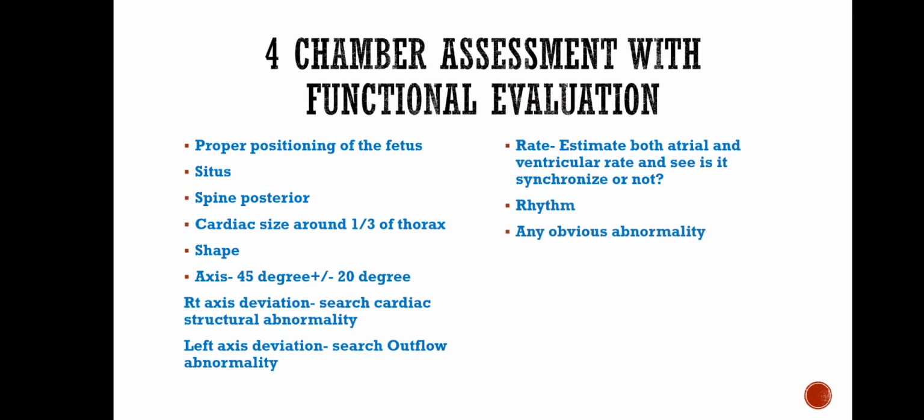Now come to the ESOG planes. See the plane of stomach and the apical four-chamber view showing the situs solitus, and there are LVOT, RVOT and three-vessel tracheal view. Come to the four-chamber assessment with functional evaluation.